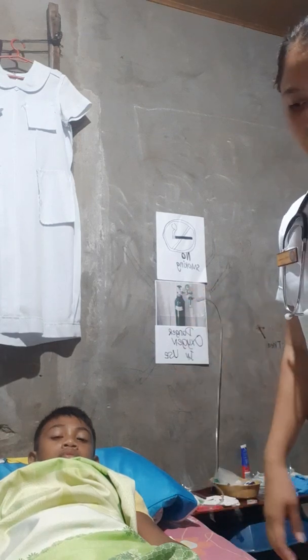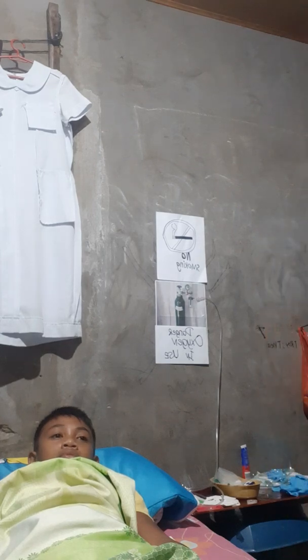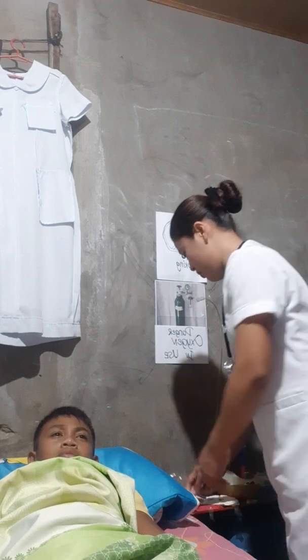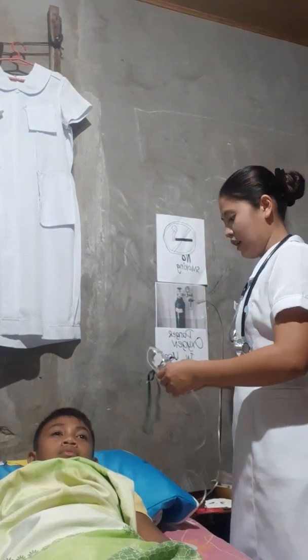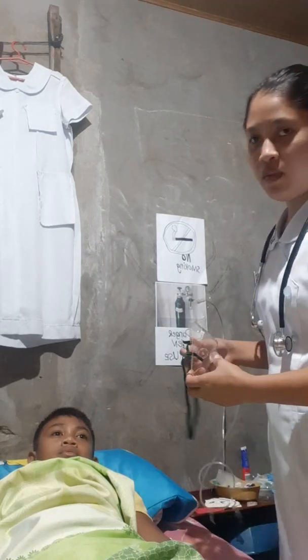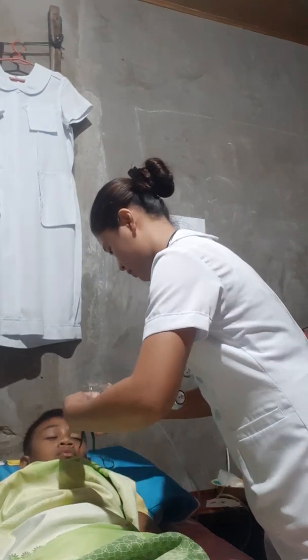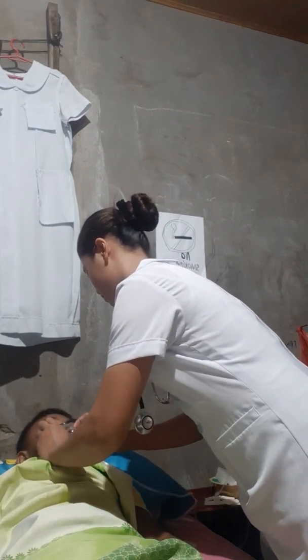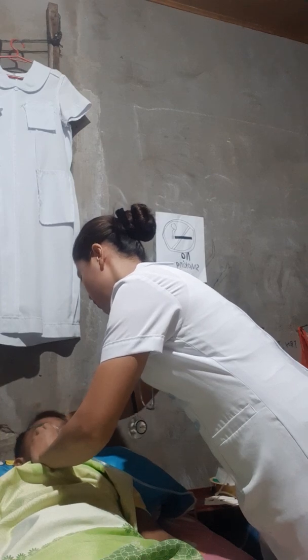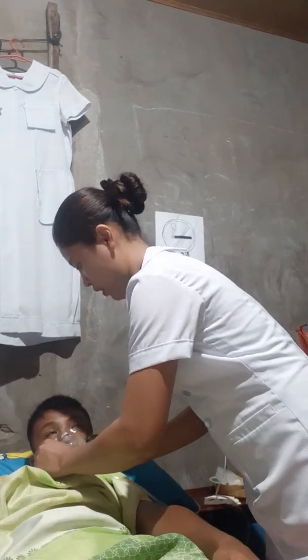Then, check for the adequate flow of oxygen in the tubing by using the posterior aspect of the arm. Then, guide the face mask onto the face of the client. Make sure to fit it so that only a small amount of air can escape.